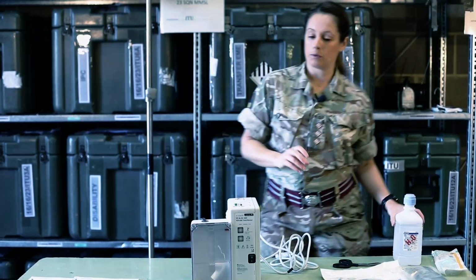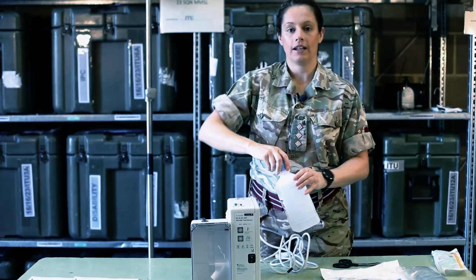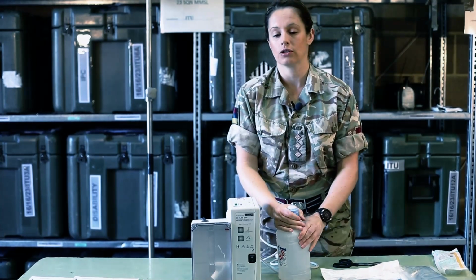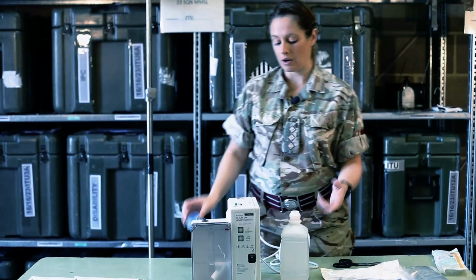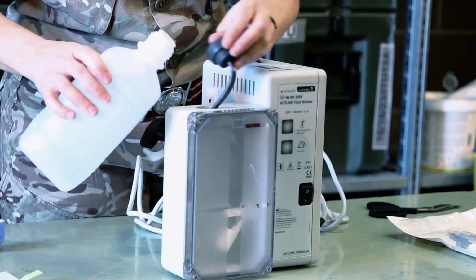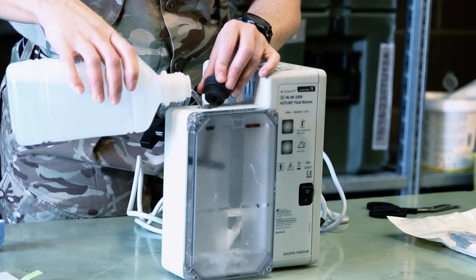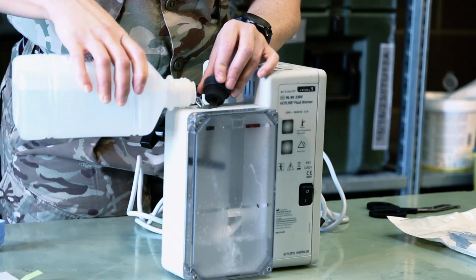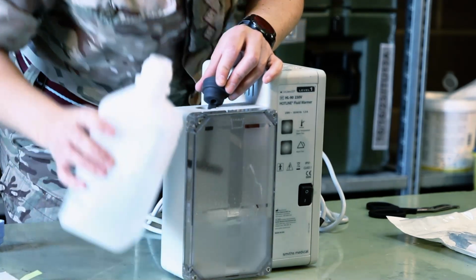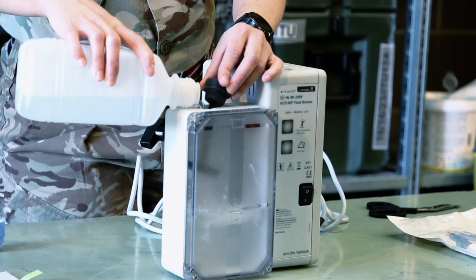So to fill the Hotline fluid warmer, we're going to use distilled water. There are other options as well in the manufacturer's guides, however this isn't something that we tend to keep in Defence. They're alcohol-based solutions and they are quite difficult to get hold of. However, distilled water is readily available. So we're just going to fill in between the minimum and maximum lines. And this water is changed every 30 days when the machine is in use.